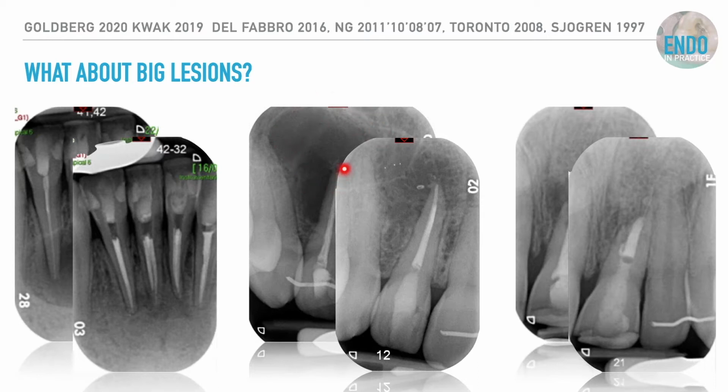If we had started to do any type of surgical procedure, we could compromise adjacent vital structures. The fact that this has now healed, or at least nearly healed, over 18 months means that if we needed to go in and do any type of surgery, we're in a lot safer position in regards to the adjacent vital structures.